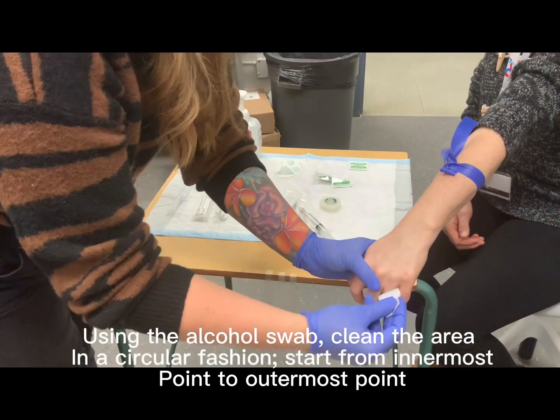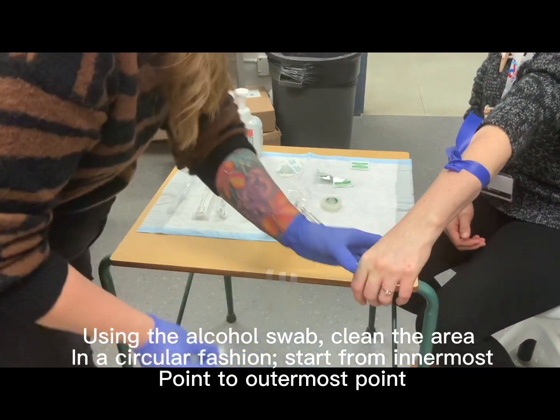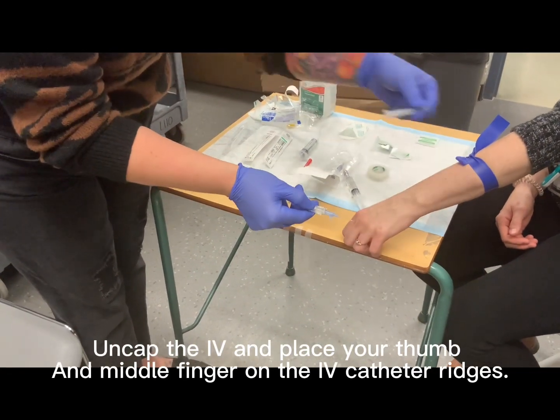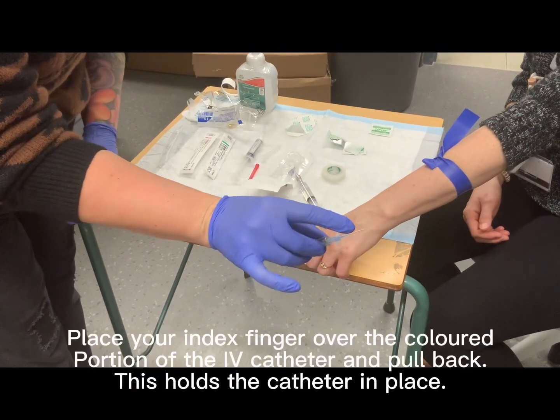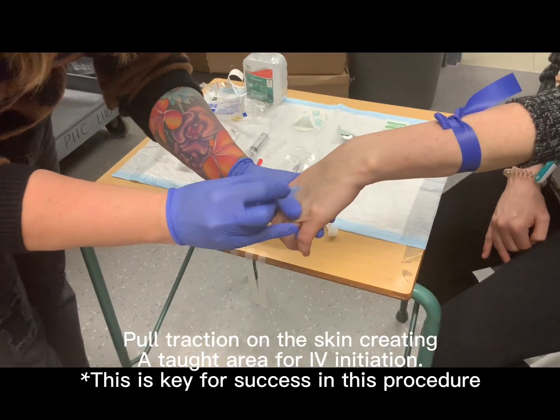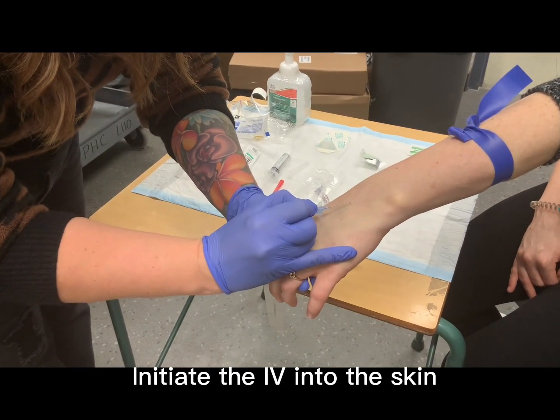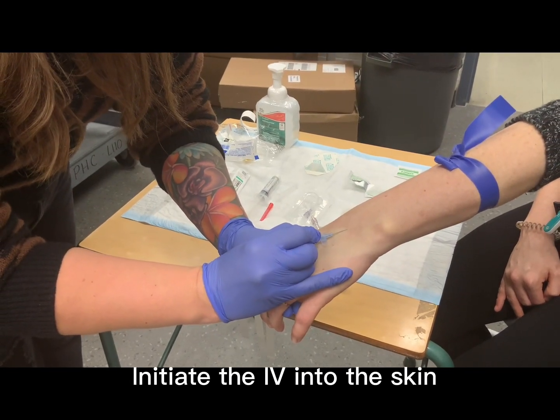It is now time to clean the area of insertion. Moving from inside to outside in a circular fashion, allow the site to dry for up to 30 seconds. Uncap the IV with a straight, smooth motion. Do not twist. Do not touch the end of the catheter and ensure that the bevel of the needle is facing up. Using your index finger to hold the IV catheter in place and your middle and thumb finger pinching the ridged areas of the IV, insert the IV into the vein.